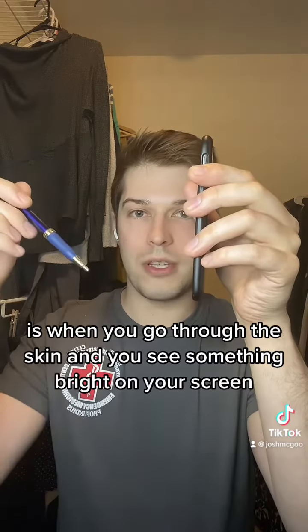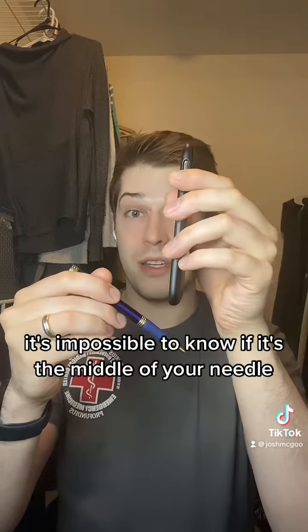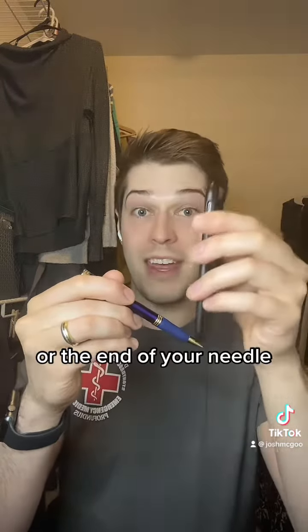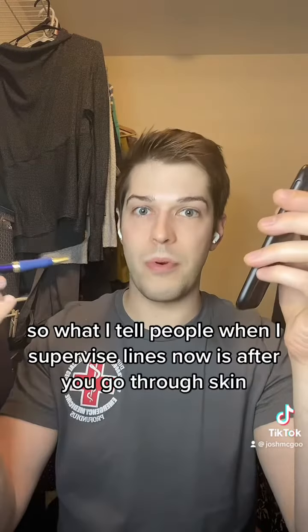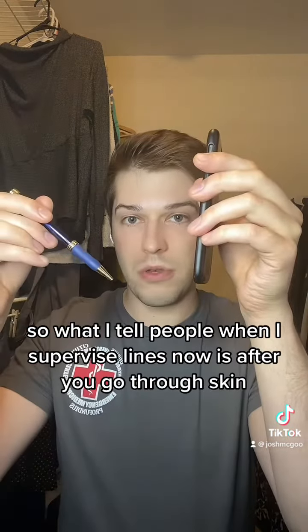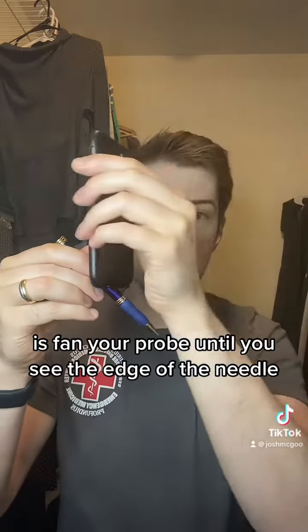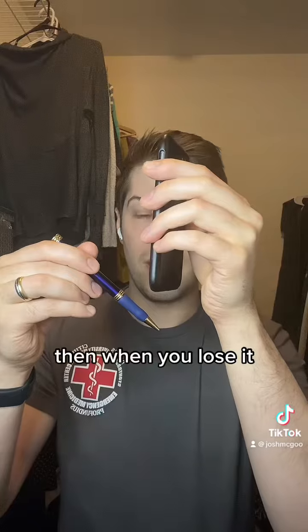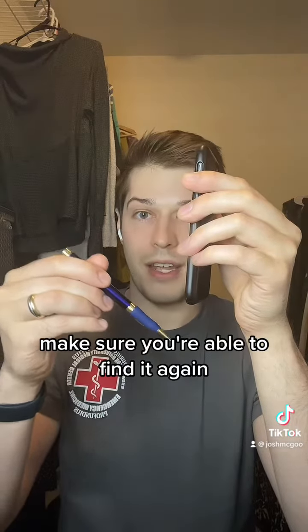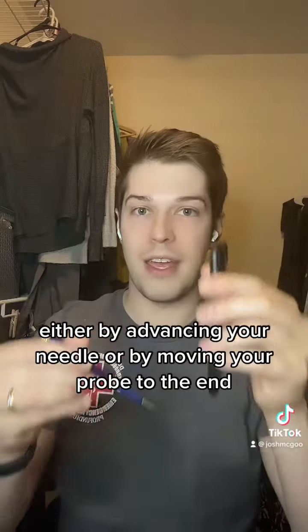When you go through the skin and you see something bright on your screen, it's impossible to know if it's the middle of your needle or the end of your needle. So after you go through skin, the first thing you need to do is fan your probe until you see the edge of the needle. Then when you lose it, make sure you're able to find it again, either by advancing your needle or by moving your probe to the end.